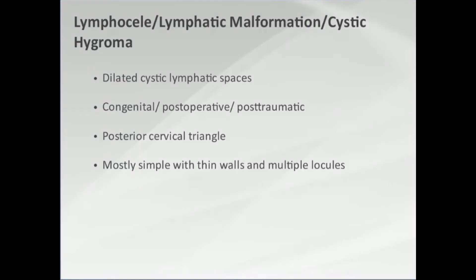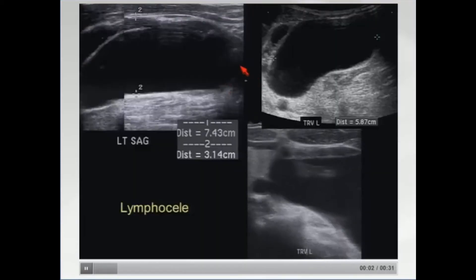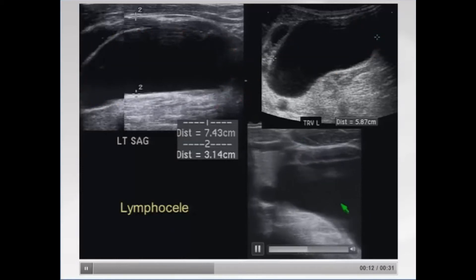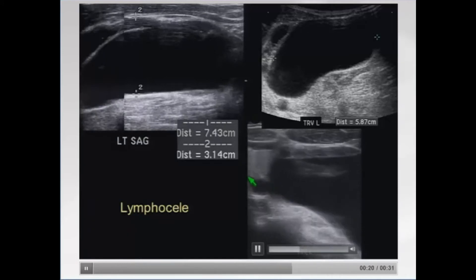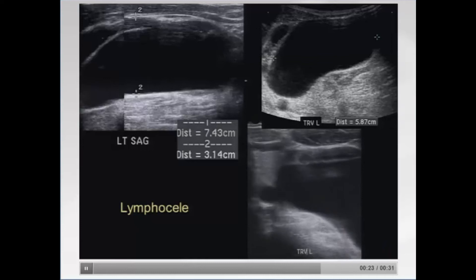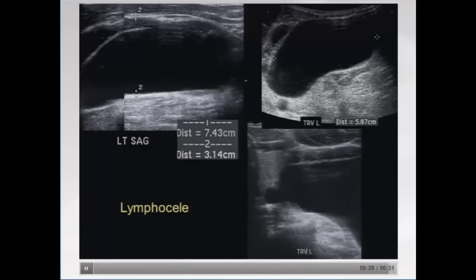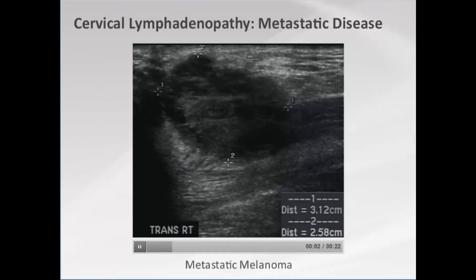Another thing to think about when you see a fluid collection in the neck is a lymphocele, sometimes called a lymphatic malformation or cystic hygroma. These can be congenital, post-operative, or post-traumatic, and occur in the posterior cervical triangle. Here's a young man with a palpable fullness — a seven-and-a-half centimeter fluid collection in the left lower neck. On the clip, when we push on it, it moves completely separate from the thyroid gland. The surgeon had to go all the way down to the thoracic duct because it was ballooning right off it.